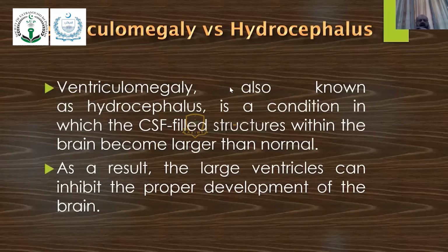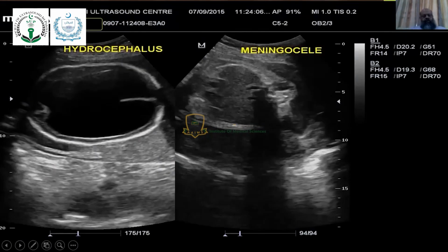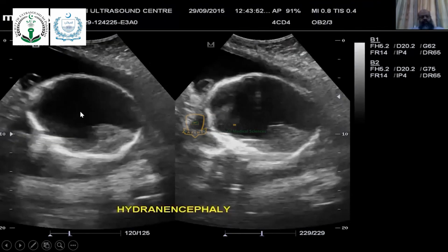This is meningocele along with hydrocephalus. You can see even the falx cerebri is not visible. Whole of the skull is with fluid. We have to perform differential diagnosis for it. We will have a few more pathologies which we will discuss, and then we will talk about the differential diagnosis of such type of presentation. If you get just fluid, what are the other possibilities? This is hydrocephalus bilateral ventriculomegaly, and here is again only fluid is visible.